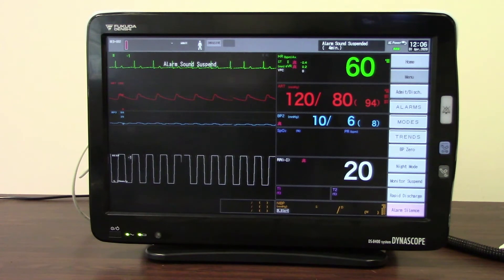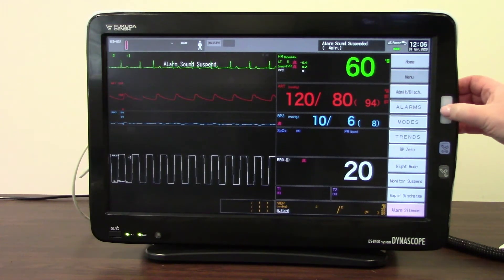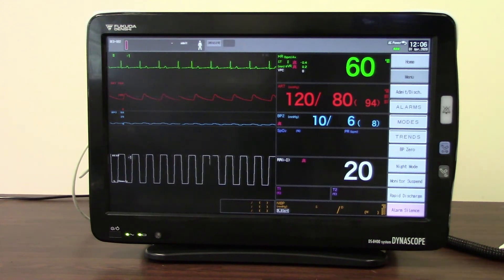If I've finished doing what I'm doing and I want to cancel that alarm sound suspend, all I need to do is press the same button just once and quickly, and it will cancel that alarm sound suspend. Now everything is back to fully alarming.